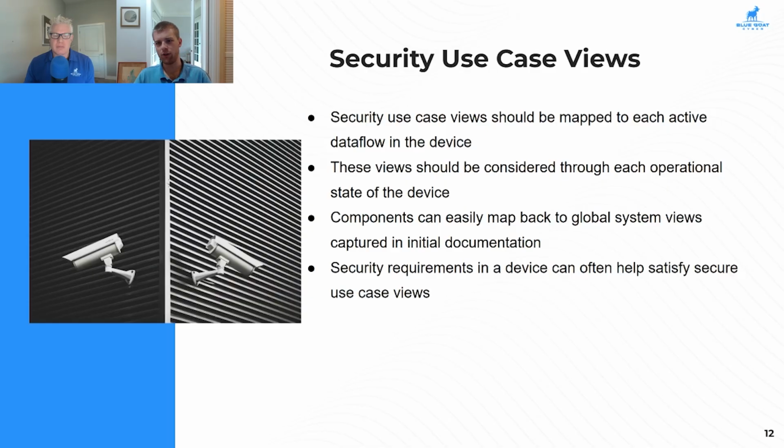It hasn't been ported over to an executable, which is weirdly a possible thing with that image file to turn it into an executable. It's a legacy requirement for the DICOM format that leads to all sorts of risk in devices. So considering things like that, verifying that it hasn't been tampered with, verifying that it hasn't been used in a risky way, verification, input validation, those are the main things that we should look at when we're addressing security and data flows.